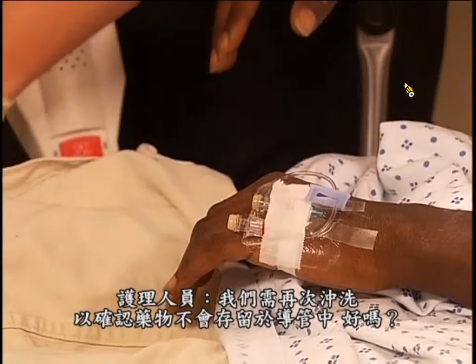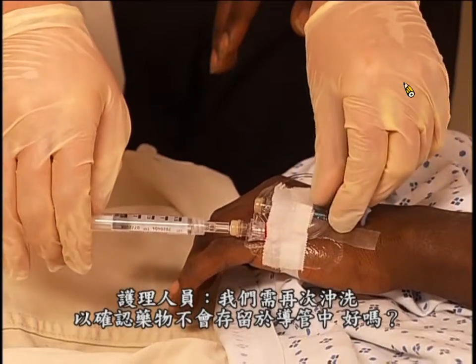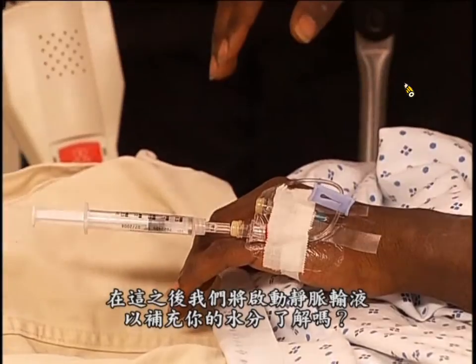And now we just have to flush one more time to make sure you got all the med that's still sitting in the tubing, okay? And then after that, we're going to start your IV fluids to keep you hydrated when you're here, okay?